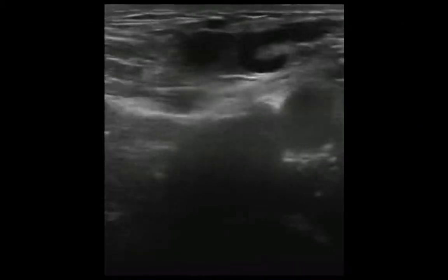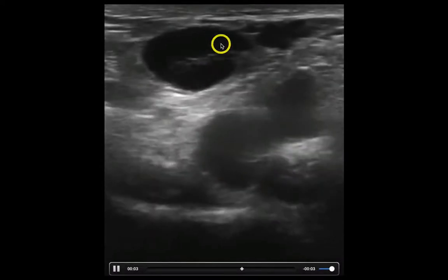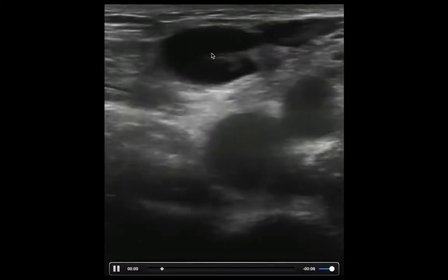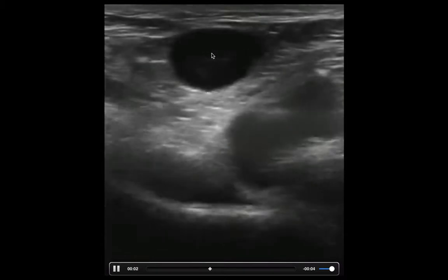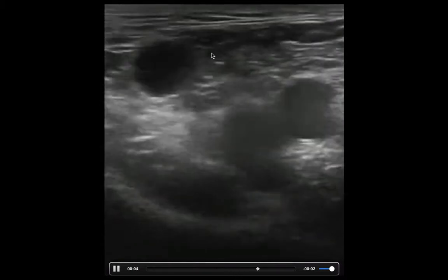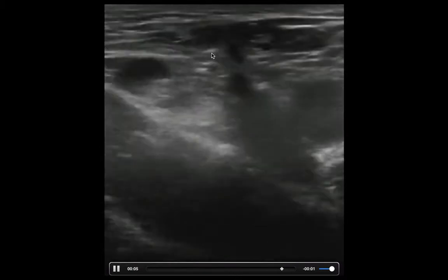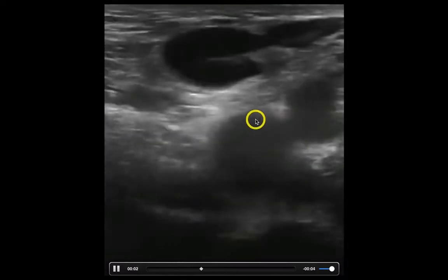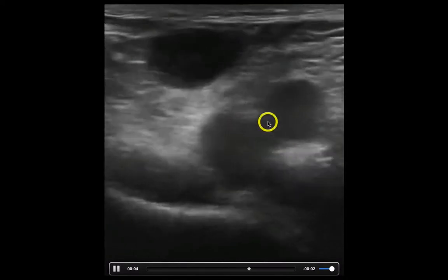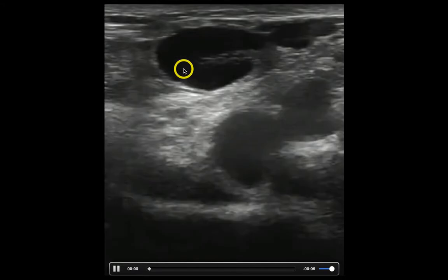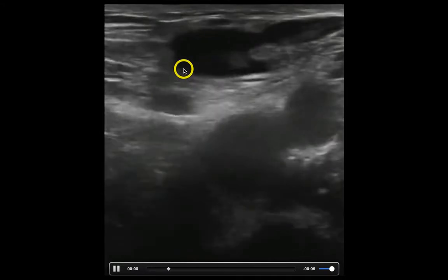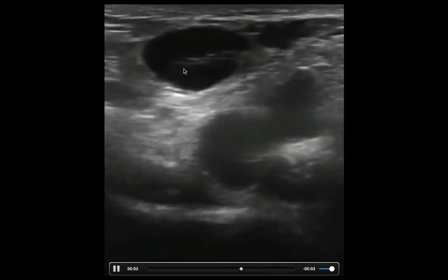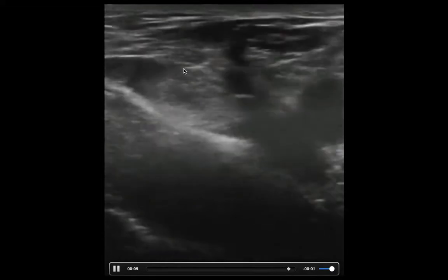One thing you have to be careful of is this structure up here. If you're not careful, you might think this is an actual DVT, but you notice as I move around, those circles actually disappear, which would make the likelihood of it being a vessel pretty low. The vessels we actually care about are all the way down here. These are actually enlarged lymph nodes that can cause symptoms concerning for a DVT — you know, pain and swelling in the groin area.